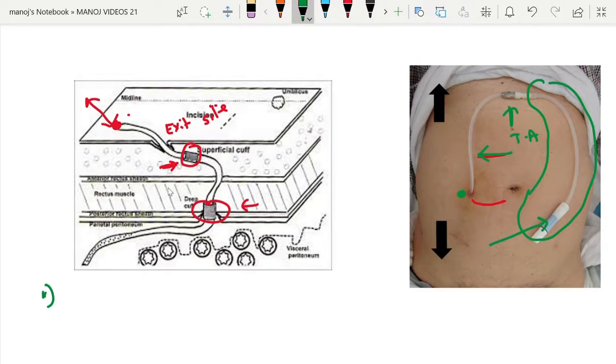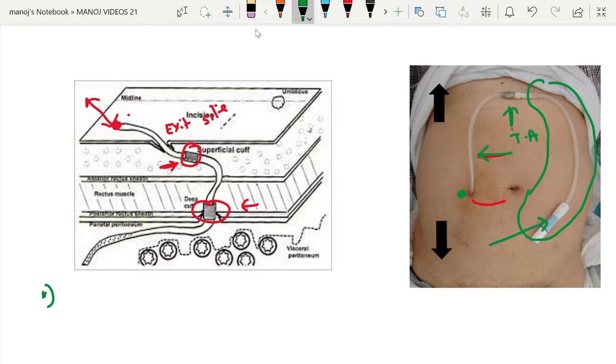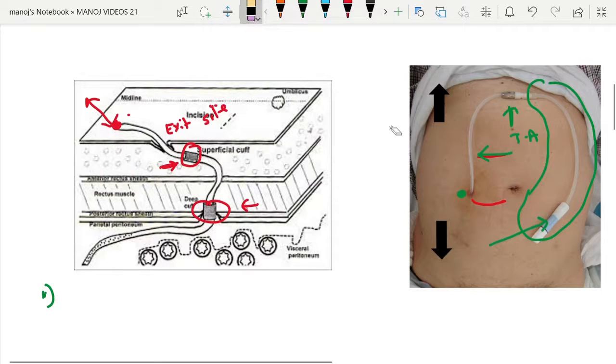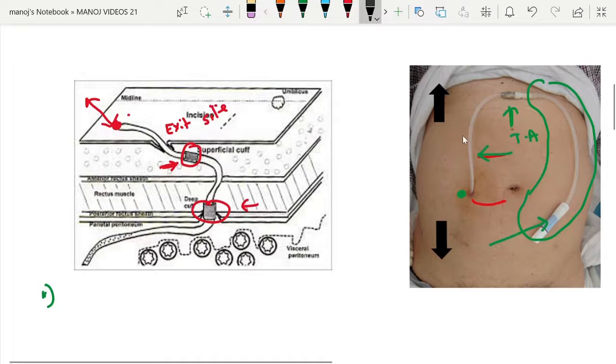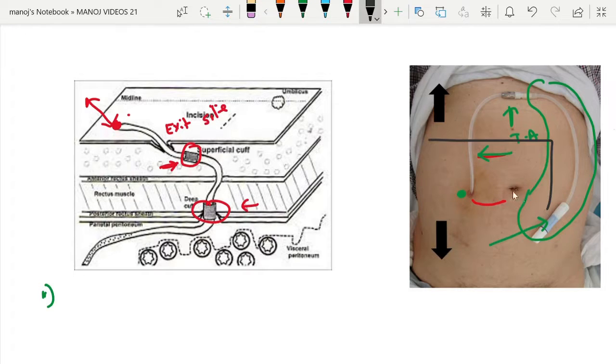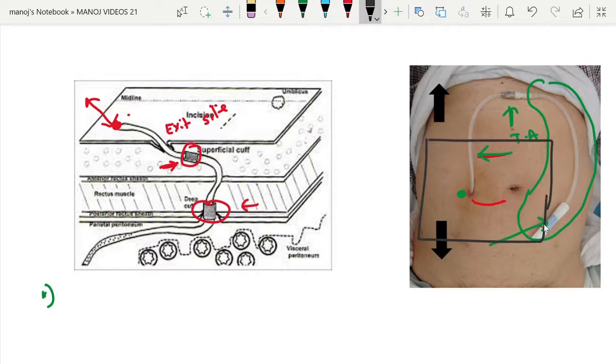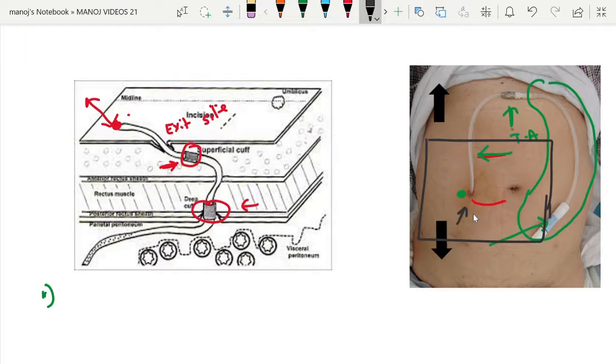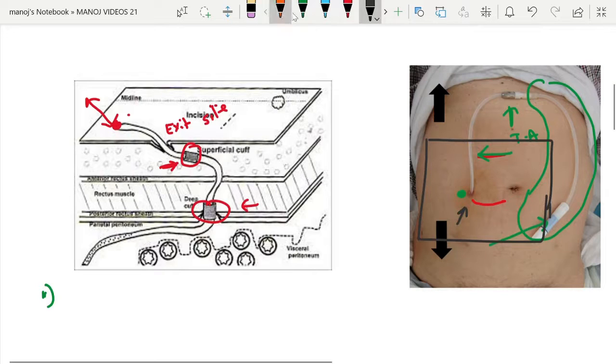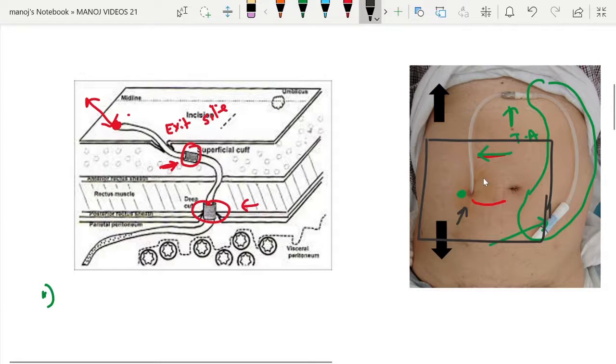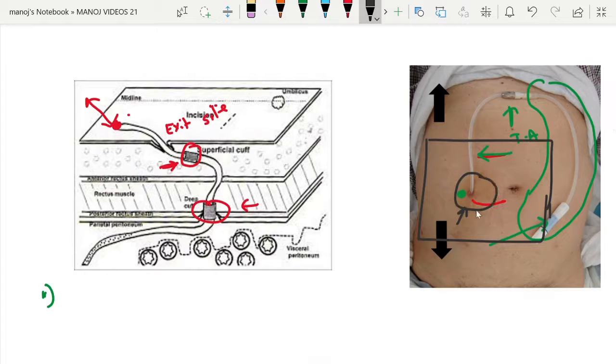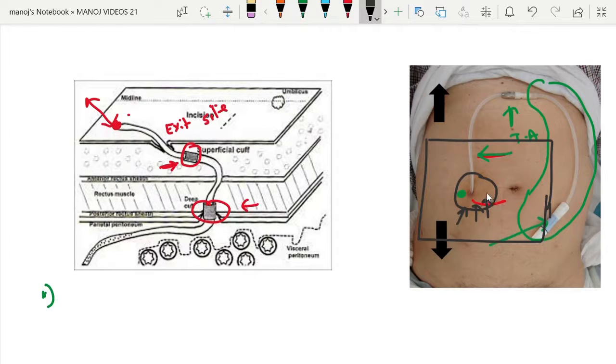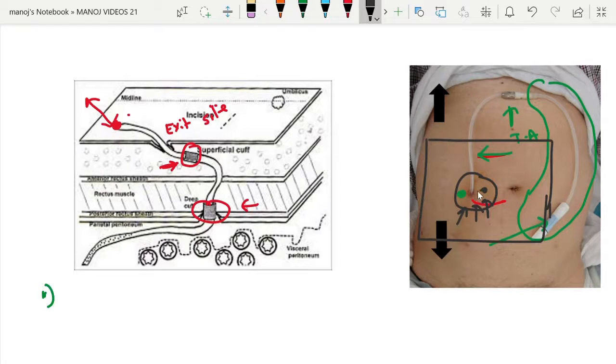First step is this entire area has to be clearly sterilized with the betadine, and at the exit site over here this area has to be given local infiltration.